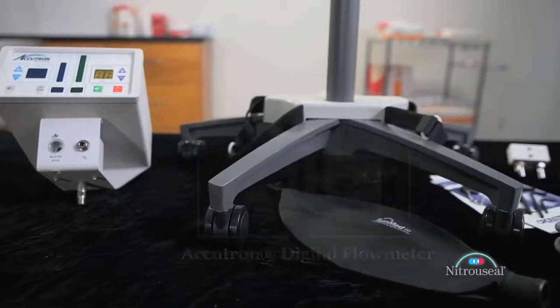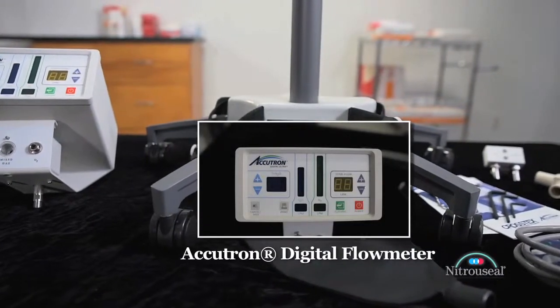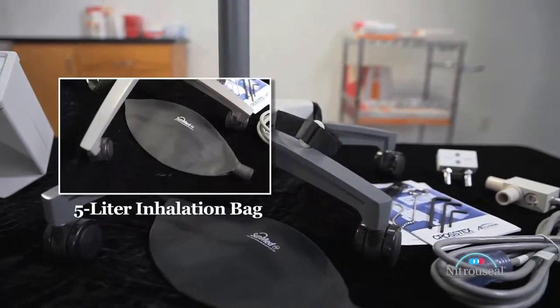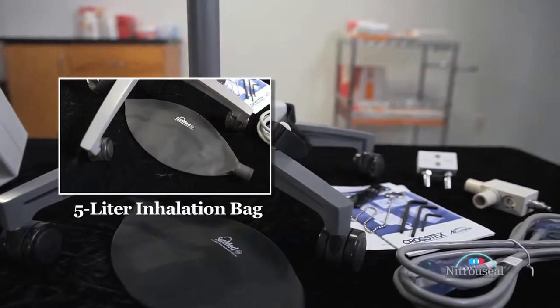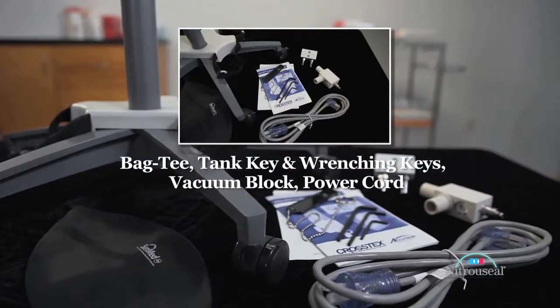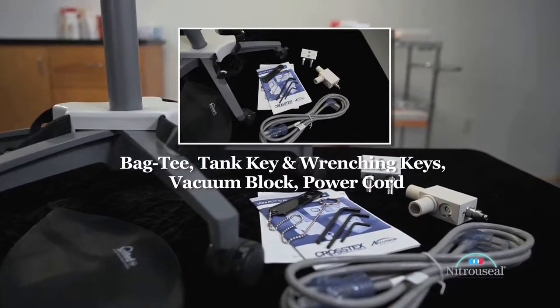Your NitroSeal system will arrive at your location in three separate containers, each containing an essential component. The large box contains the Accutron digital flow meter, the mobile stand with a four-tank manifold bracket, and accessories including a 5-liter inhalation bag, bag T, tank key and wrenching keys, a remote vacuum block, and an electrical power cord.